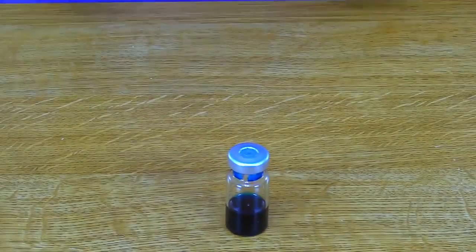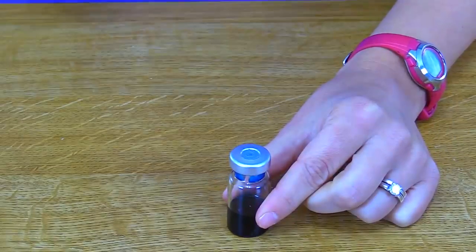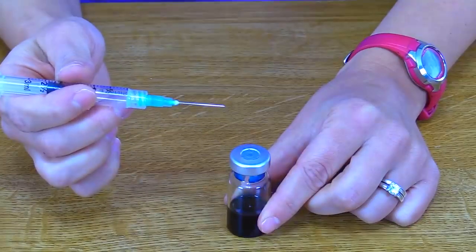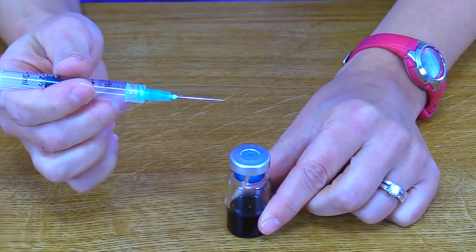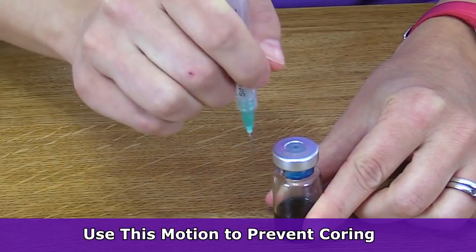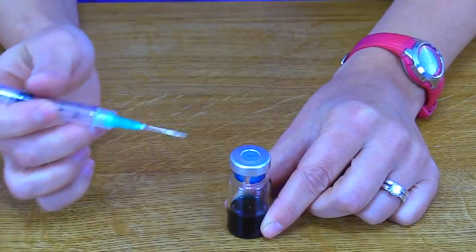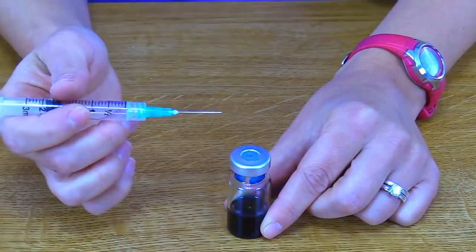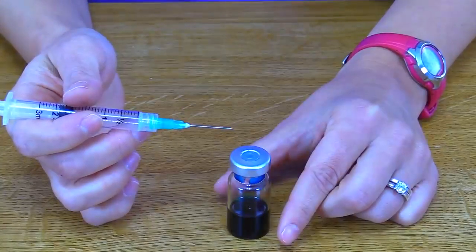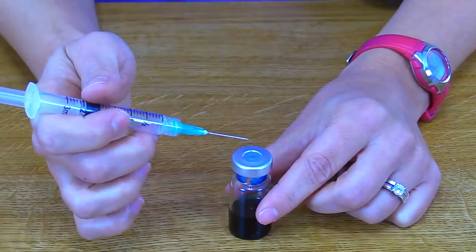Now to inject air into the vial, I'm going to hold the vial steady on a flat surface with my non-dominant hand, and then I'm going to take my dominant hand and hold the syringe at its barrel. Now, whenever you're using a needle to pierce the top of a rubber stopper, you want to use a technique that prevents coring. So what is coring? Well, coring occurs when parts of this rubber stopper enter into the vial and contaminate the vial, and possibly some of that rubber stopper could be injected to the patient, and we want to absolutely prevent this. So you can use a certain technique to hopefully prevent that.